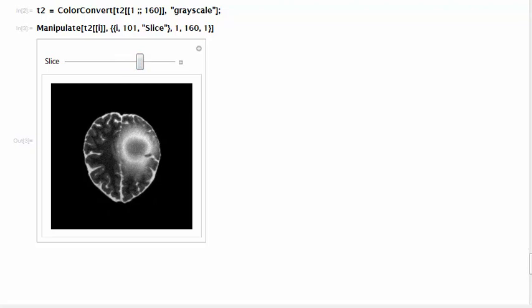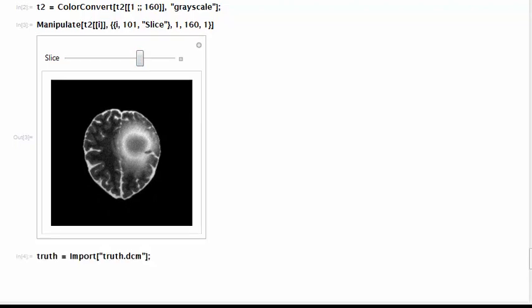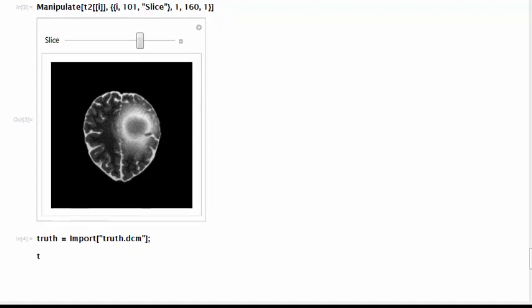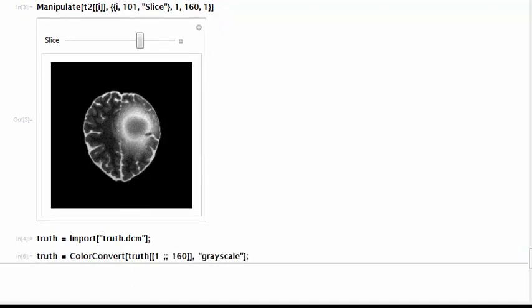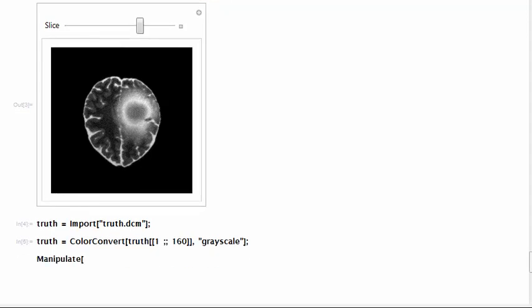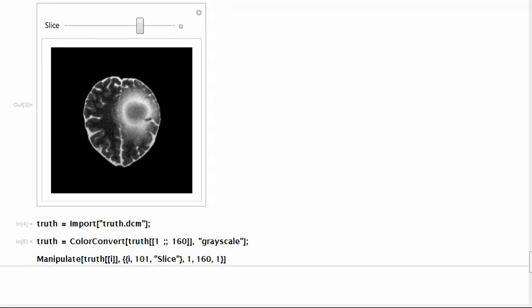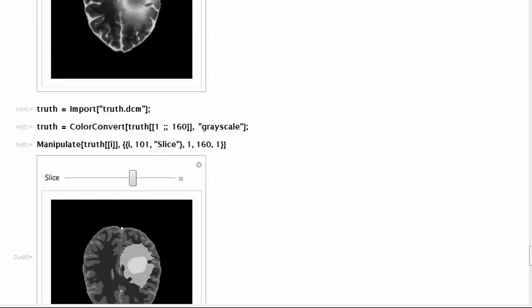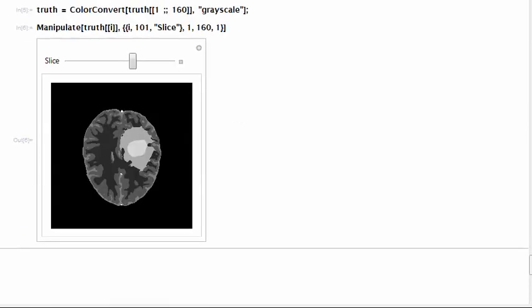We start by importing the truth dataset and converting it to grayscale as we did to the t2 volume. When inspecting it with manipulate one can notice that it's the exact same brain that we had on the t2 dataset, but it's already segmented.